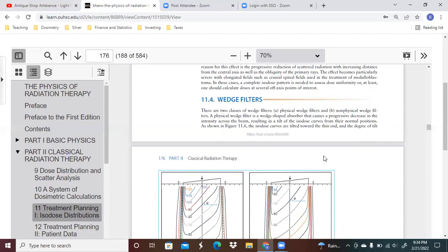The EDW, as it's referred to, at least as far as Varian equipment is concerned, only works in the Y direction. So you can have it go one way or the other in the Y direction. If that doesn't suit your needs, then you end up having to turn the collimator 90 degrees to get the other direction.